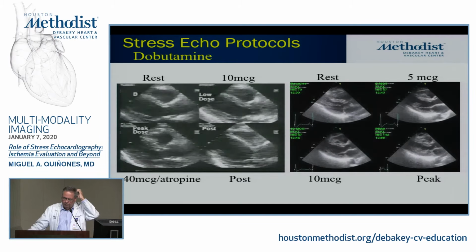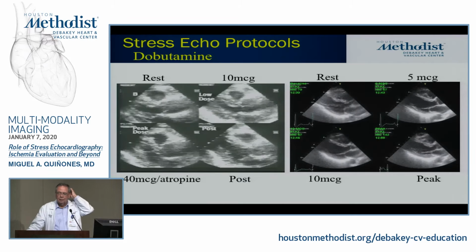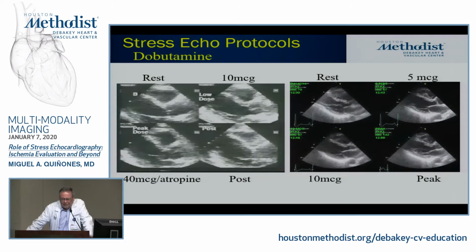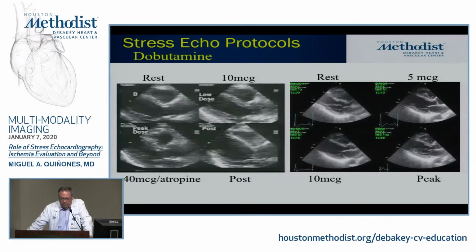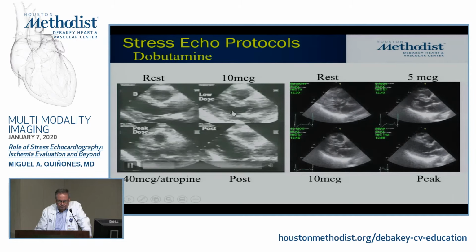You can get a lot of PVCs. You can get some non-sustained VTAC. And occasionally you can get a little bit more trouble. But that's very rare. Overall, the safety is not a problem. The problem is the cavities get very small, very small.